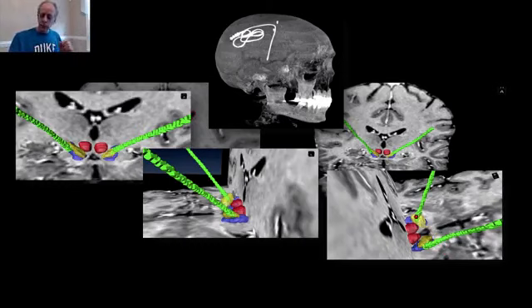Electrodes actually have multiple contacts. Some have 4, some new ones coming to the market have 16. And these post-op images can help the programmer say which one of the contacts will be more effective according to the position where I have localized them.